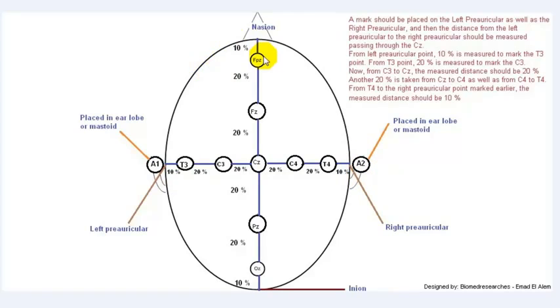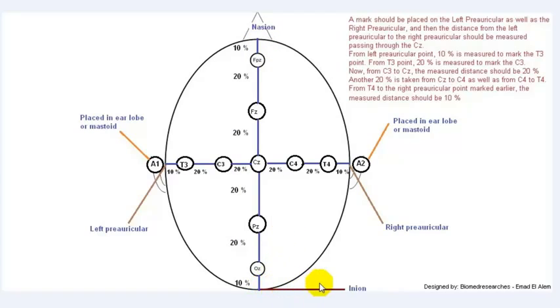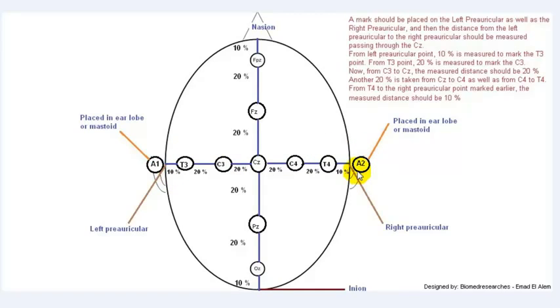By now we have finished the central zone electrodes from nasion to inion, and from left auricular to right auricular. To review: a mark is placed on the left and right auricular points, and the distance between them is measured passing through CZ. From the left auricular, 10% marks T3; from T3, 20% marks C3; from C3 to CZ is 20%. Another 20% goes from CZ to C4, and from C4 to T4; from T4 to the right auricular should be 10%.